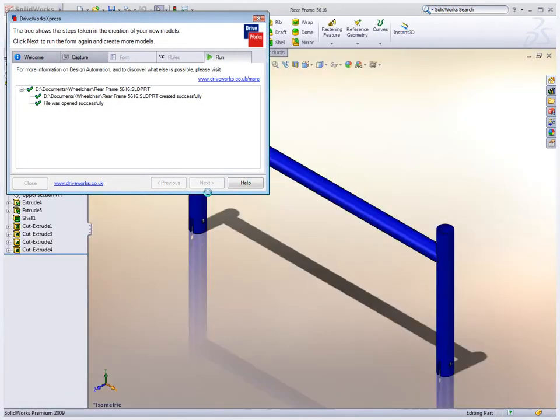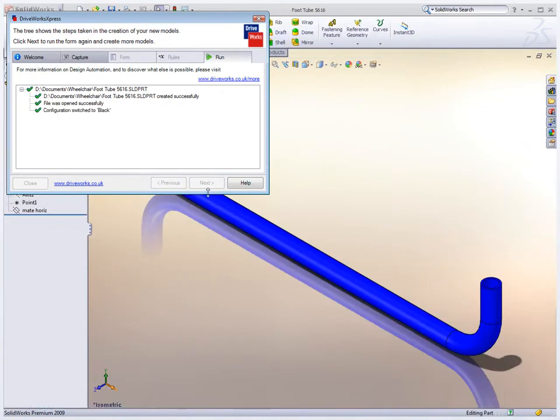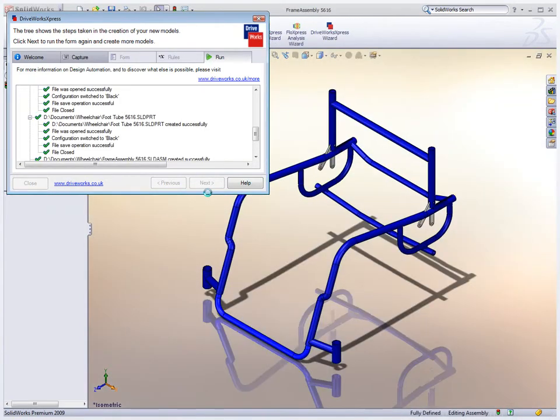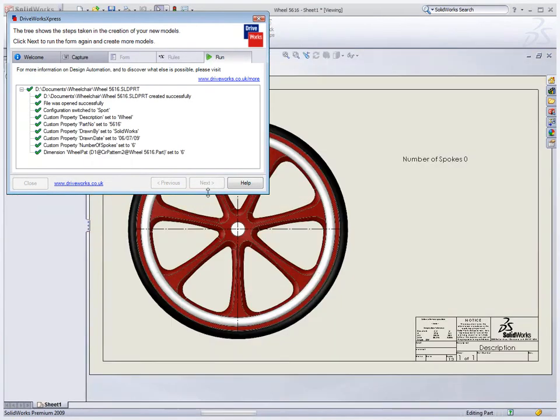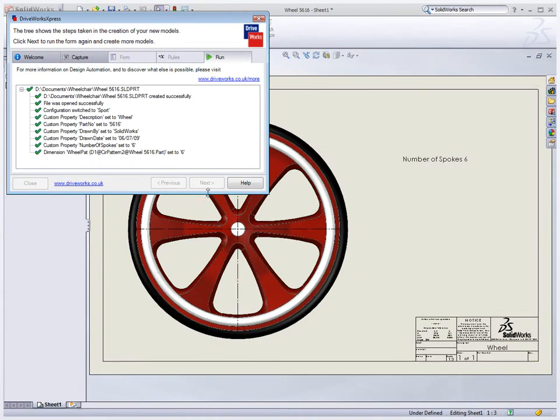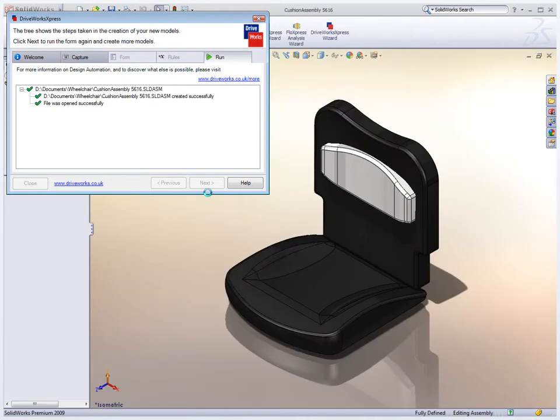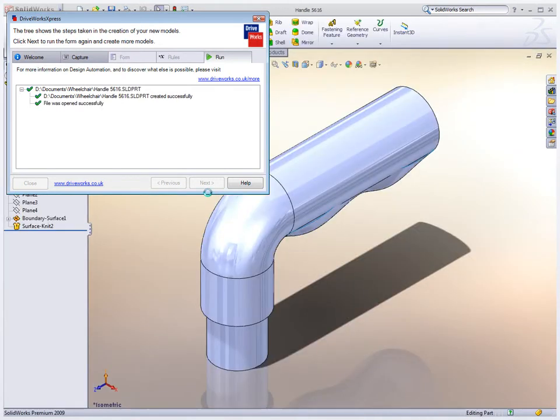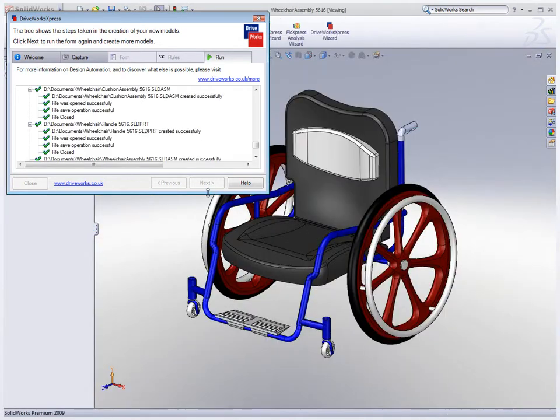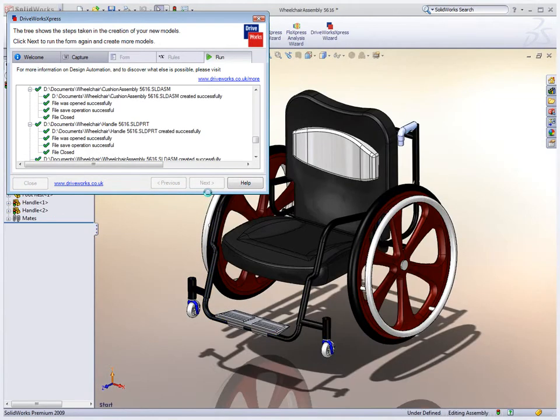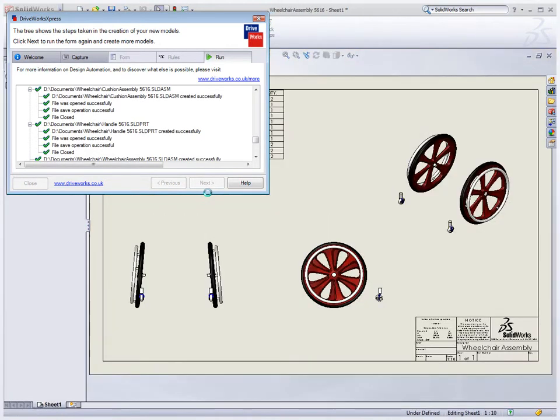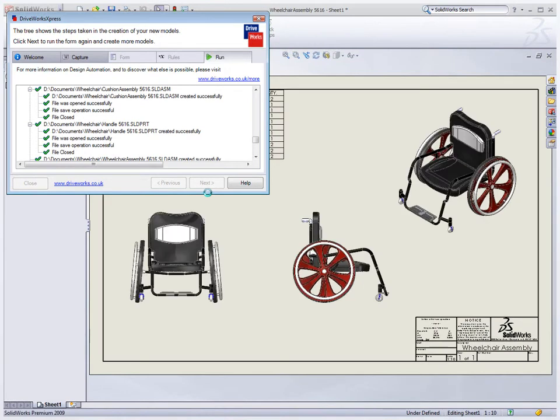For a wheelchair, things such as wheel design, color, or the overall size of the frame may be important factors. DriveWorks Express generates an entirely new design in a matter of minutes, with little or no effort.